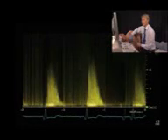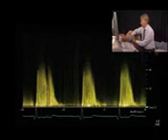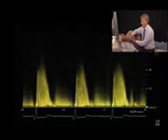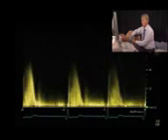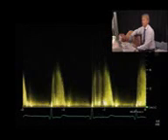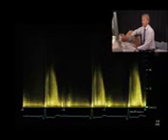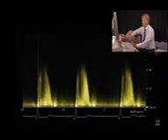So here we see a signal which is the aortic valve, but not in a very good quality. So I will now tilt the transducer more cranial, and the signal improves. Small motions, and the velocity is somewhere in the region of maybe 4.5 meters. But we do not know if this is really the maximal velocity.